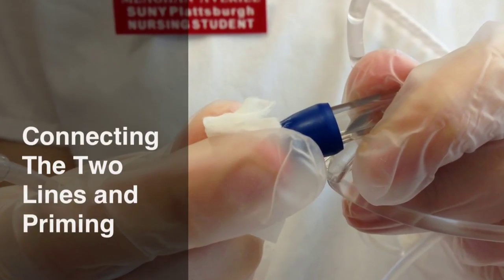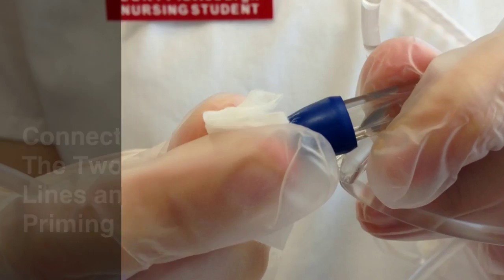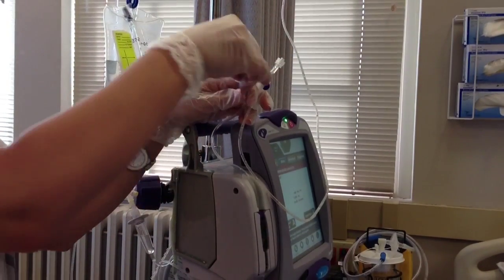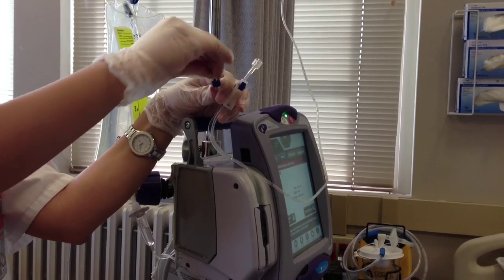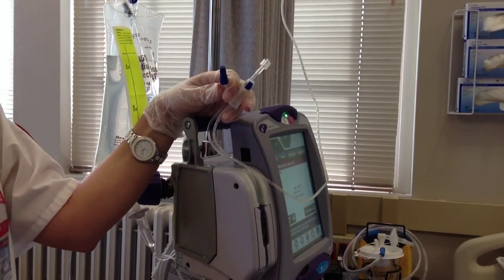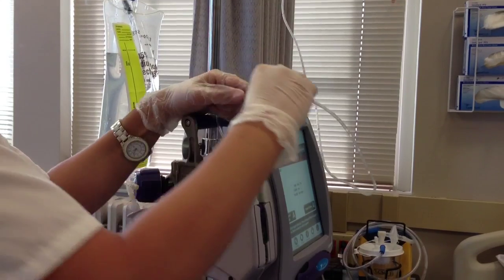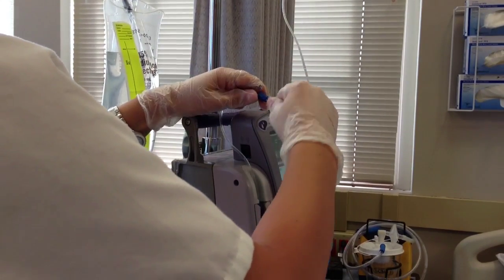Before you can back prime, you're going to connect the two lines together. To do this, take an alcohol swab first to thoroughly clean the port right above the cassette on the primary line. Once it's thoroughly cleaned, you can connect the secondary line to the primary line.